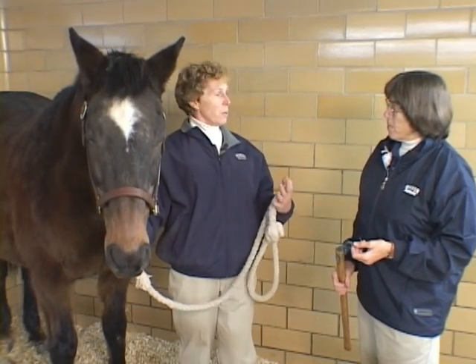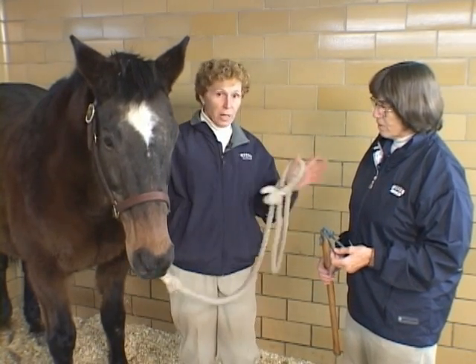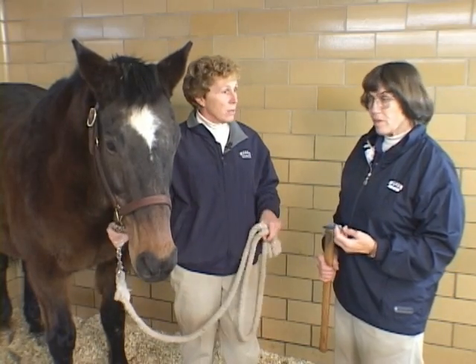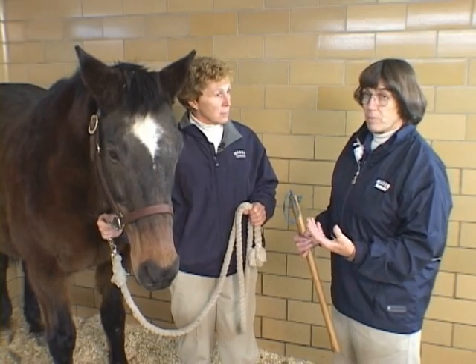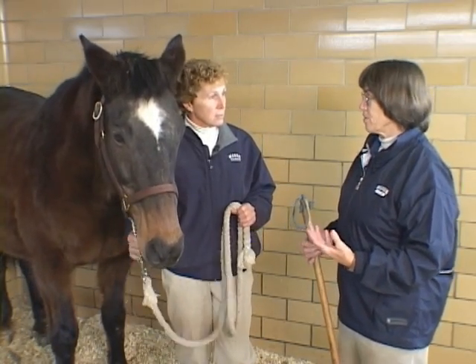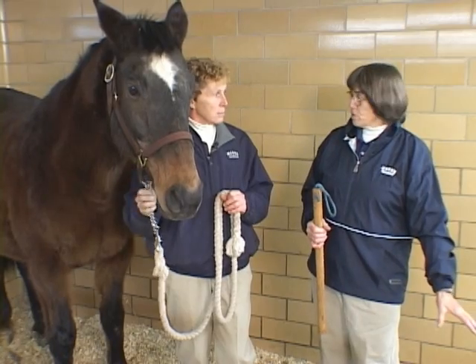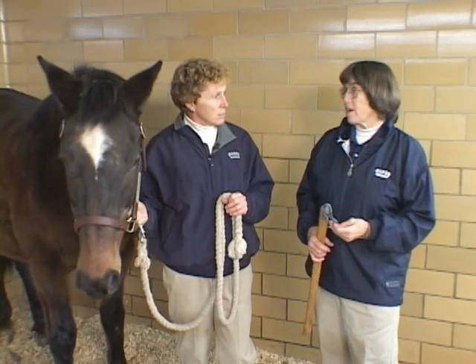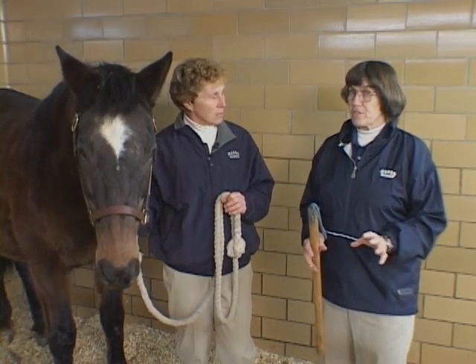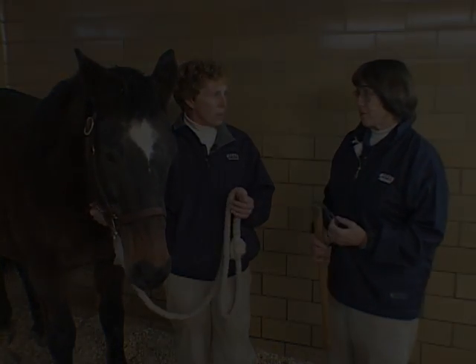Last, we have to think about what you're going to do with the client while this is going on. We want the horse to be safe, we'd like to be safe, and we very much would like for the client to be safe too. You saw with the technique we used, there were two of us — sometimes it would be handy to have three people, and the client sometimes wants to get involved. There can be times when we may have the client administer some of the medication because we're tied up controlling the horse, but we try not to do that. We try to have them standing out of the stall so we know where everybody is, we're working as a team, and nobody gets hurt — just in case the patient starts to explode.